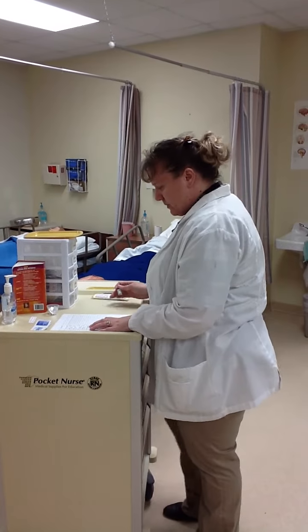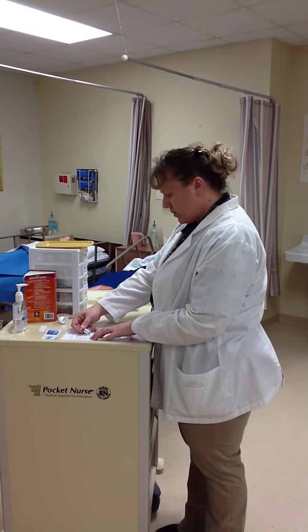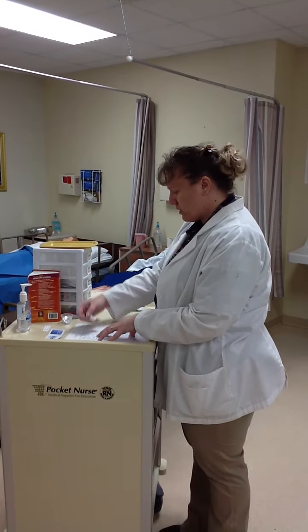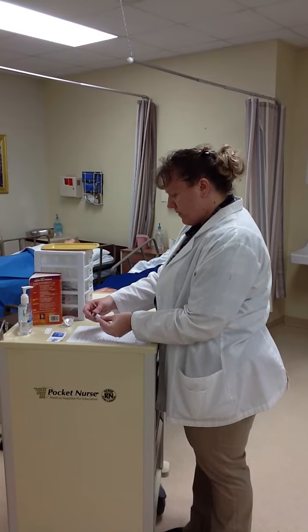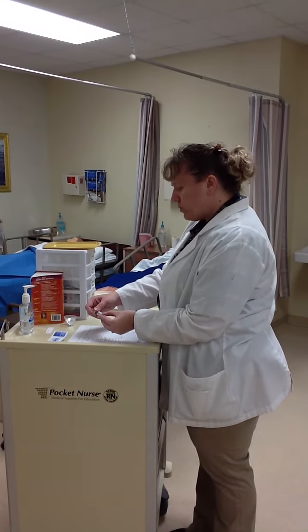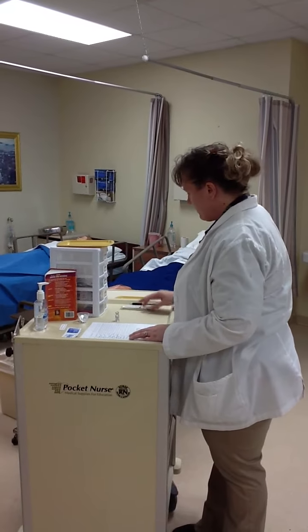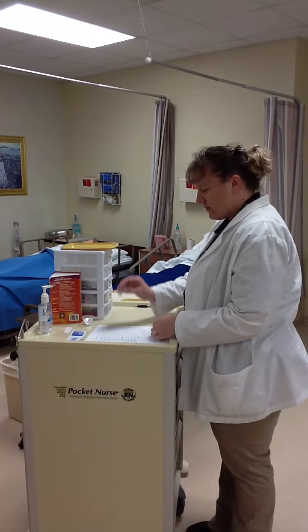I'm going to look at this. I have a PPD tuberculin. I'm supposed to use 0.1 ml. It's intradermal, and it's to be done today and read in 72 hours. Looking at my vial, I have a Practi PPD. It is 5 tuberculin units at 0.1 ml, and it expires in 2020. That is my first check of the vial.